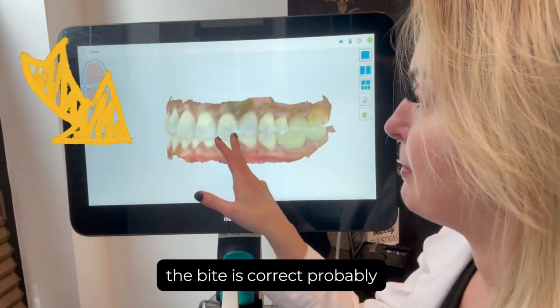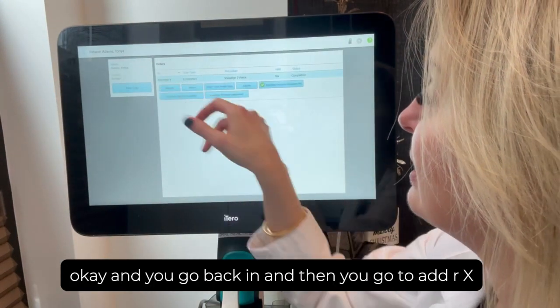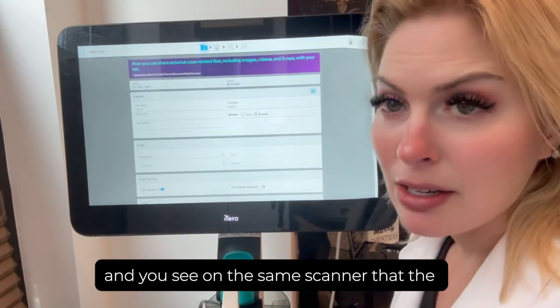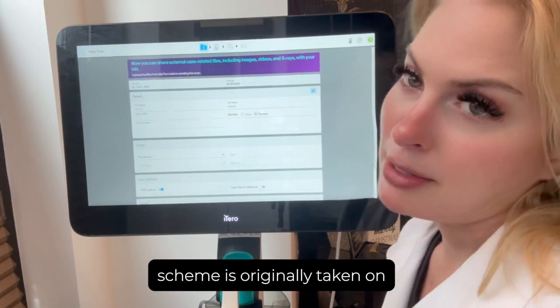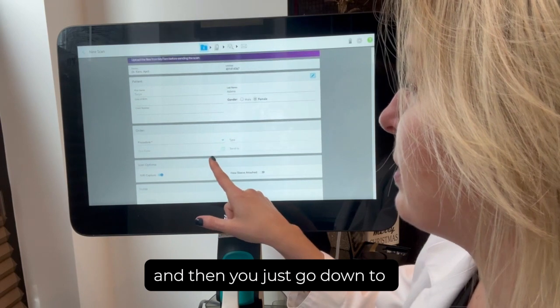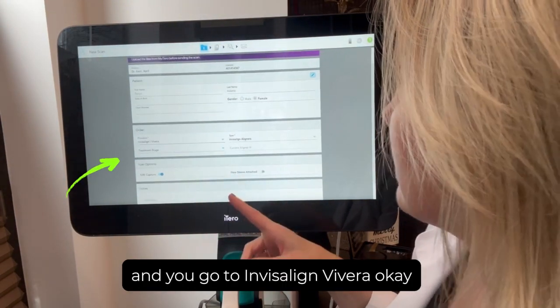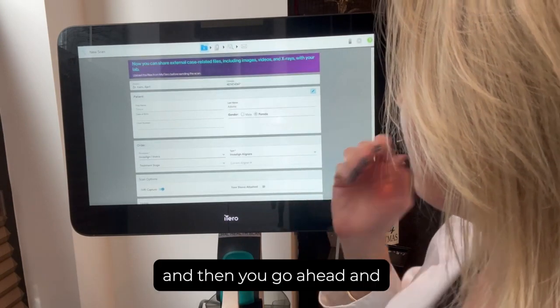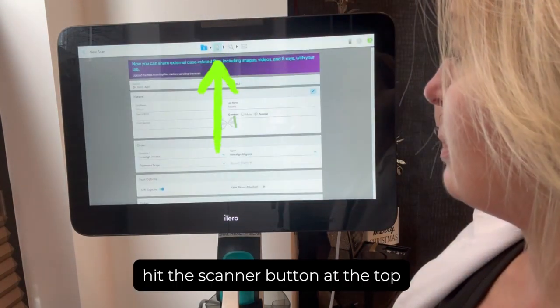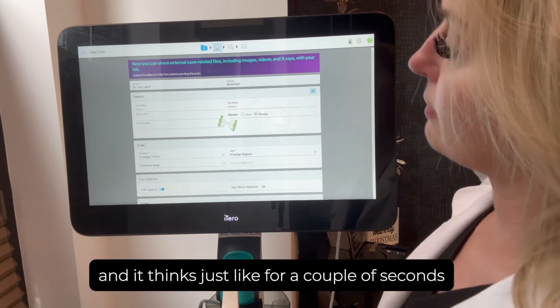Using a scan where the bite is correct as an example, you go out and then go back in and go to 'Add Rx.' It needs to be on the same scanner the scan was originally taken on if you have more than one scanner in your office. Then go down to 'Scan Procedure,' select the patient — Miss Rivera in this case — and hit the scanner button at the top. It thinks for just a couple seconds.